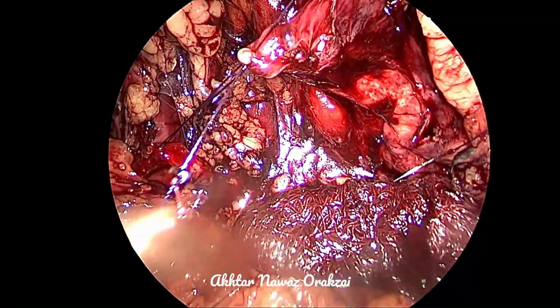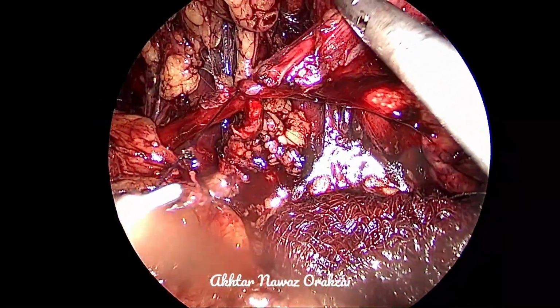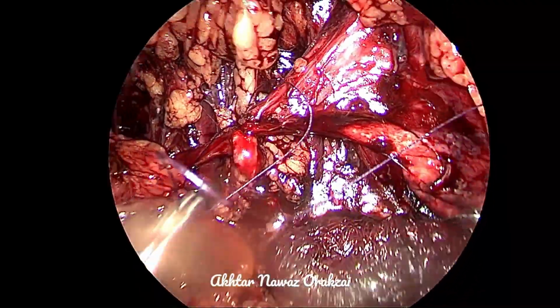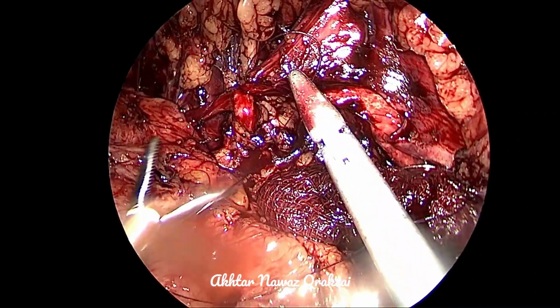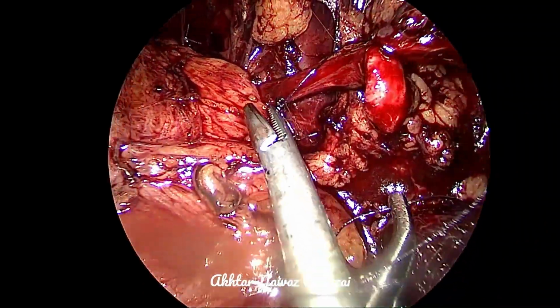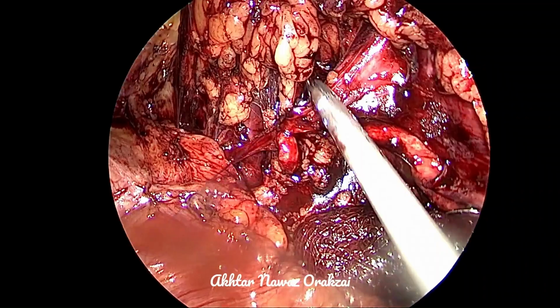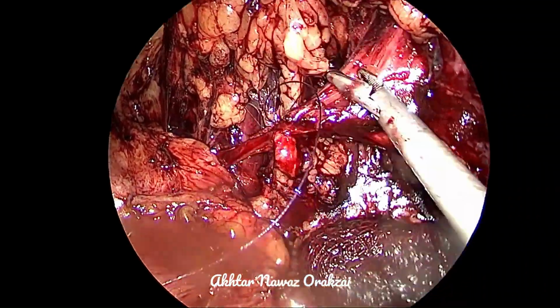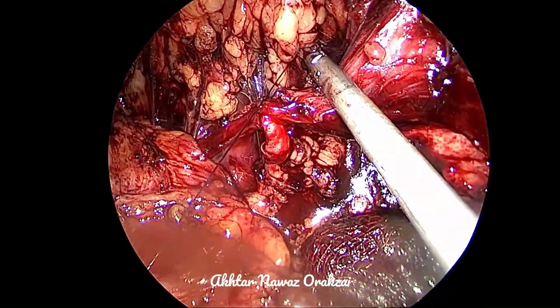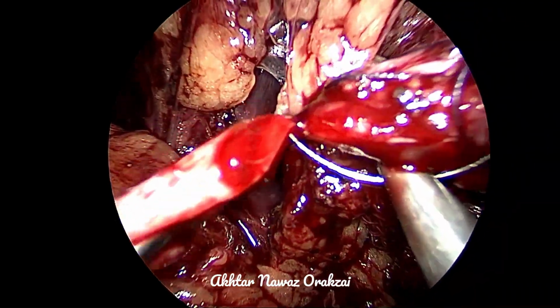So once again, as before, we have discussed the principles of pyeloplasty. This is basically Anderson-Hynes pyeloplasty. Anderson-Hynes pyeloplasty is a dismembered pyeloplasty, which is one of the largest number of pyeloplasties performed. In this, we resect the segment of the ureter which is deficient of muscles and does not have peristalsis. Lack of peristalsis leads to obstruction. So that pathological segment needs to be resected.